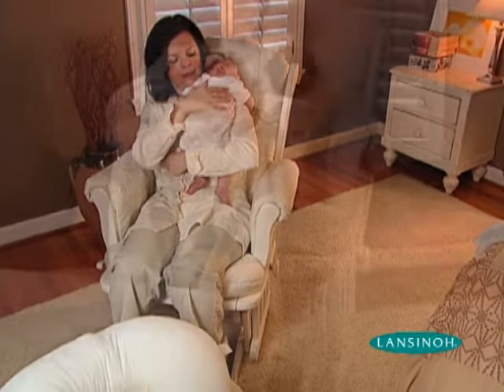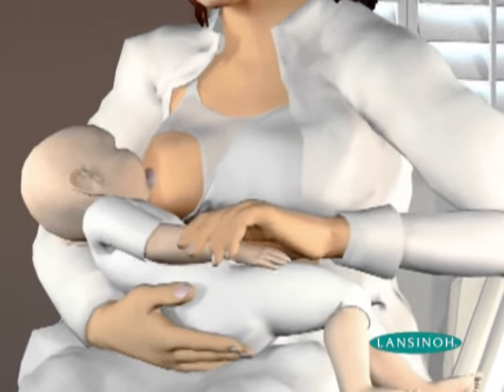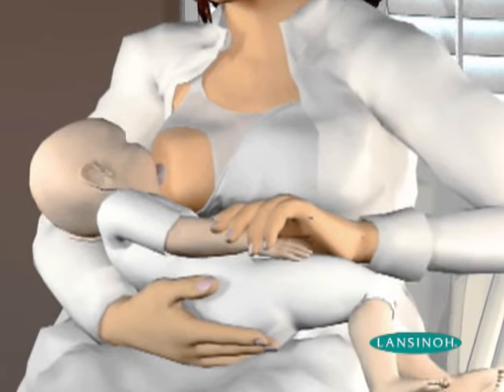Have your baby positioned for breastfeeding. This will enable you to use the Latch Assist with one hand so that your baby can latch onto your breast as soon as your nipple is everted.